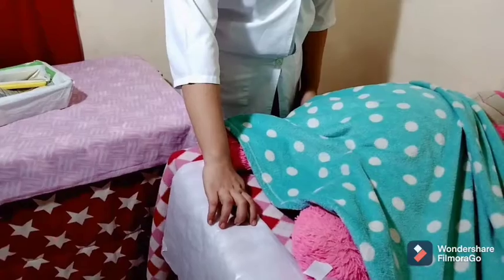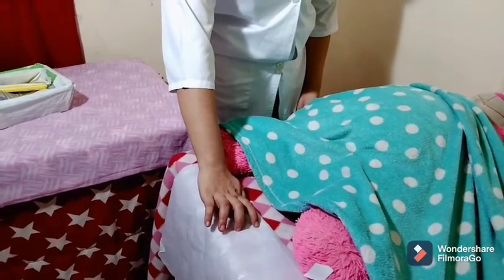Replace the top sheet with a bath blanket. Place a waterproof underpad under the client's buttocks. This protects the bed linen from moisture and from getting soiled. Can you lift your buttocks so that I can slide this underpad?